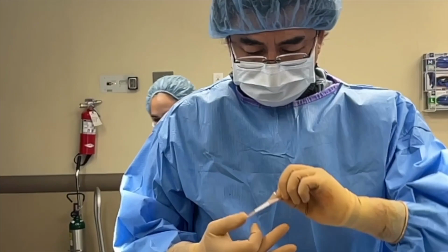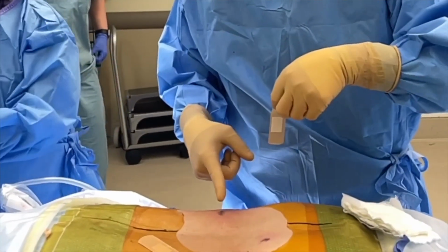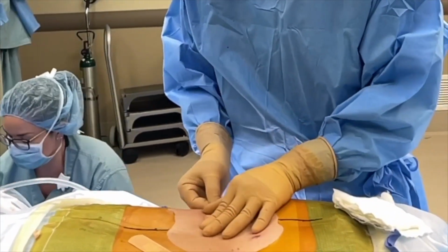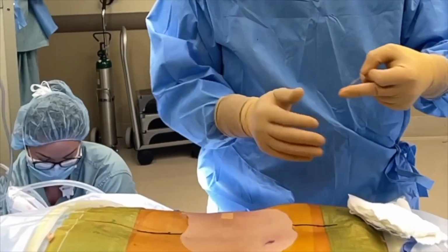Okay, Band-Aid surgery at its best. I did both surgeries through one incision, but one had to be more inside than the other, so a little bit longer than it needed to be, but still adorable. That's for the navigation tracking pin.